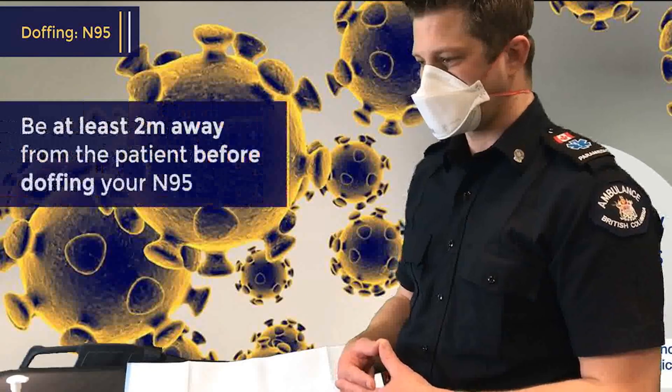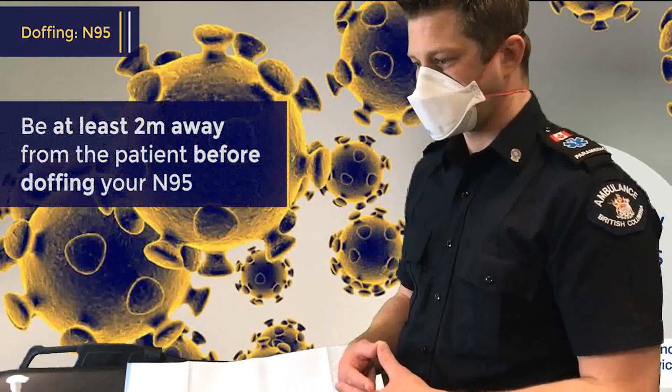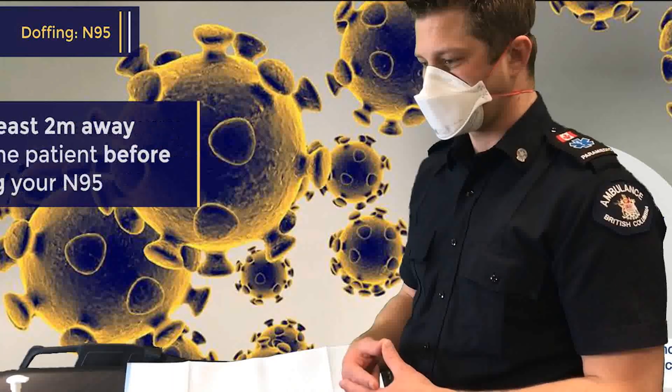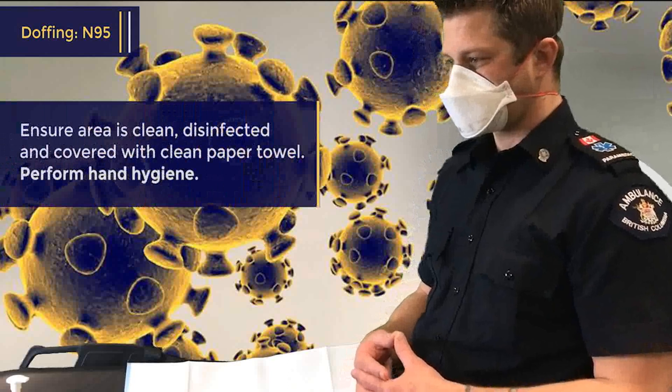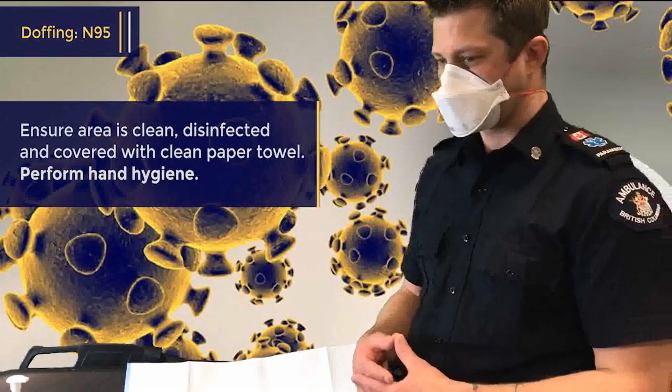So at this point, it's worth remembering we should be at least 2 metres away from the patient. Greg has already cleaned the area, disinfected the area and put down a clean paper towel to put the mask on.